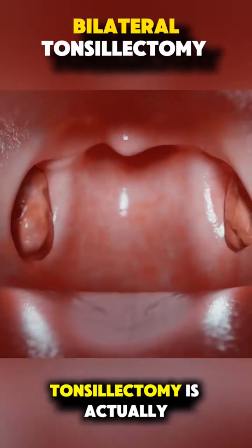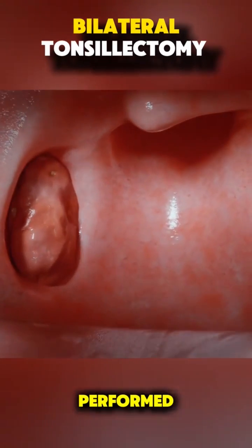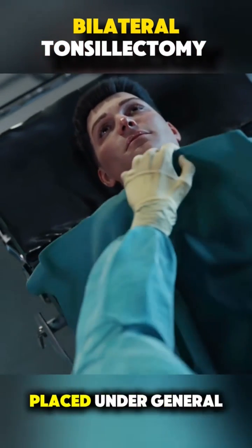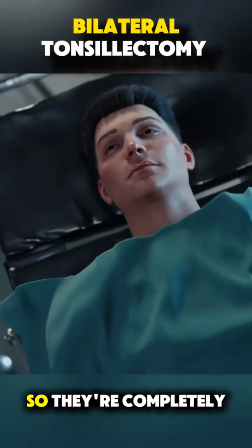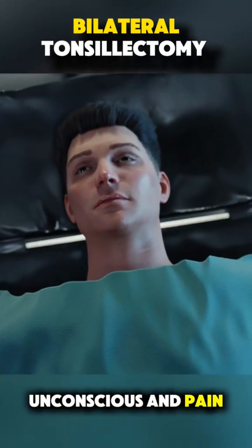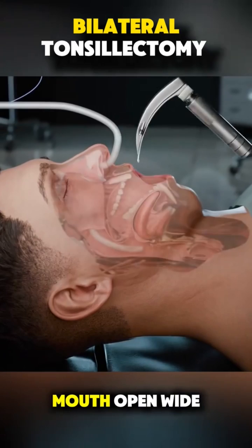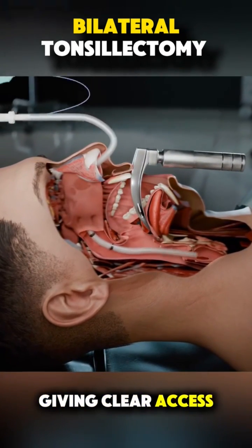Ever wondered how a bilateral tonsillectomy is actually performed? Let's break it down. First, the patient is placed under general anesthesia so they're completely unconscious and pain-free. The surgeon uses a special mouth gag to keep the mouth open wide, giving clear access to the throat.